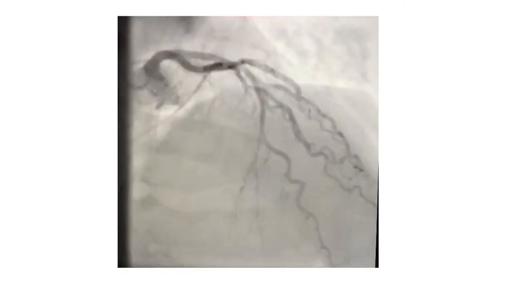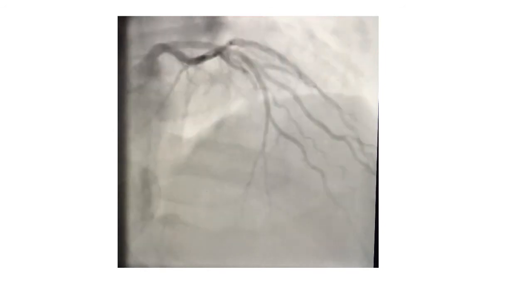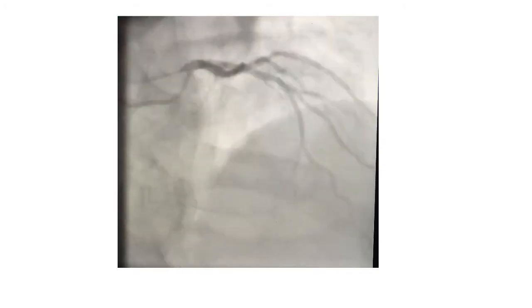The other thing you will see here is that the diaphragm is very prominent. This raises the possibility that this is a cranial projection. In fact, this is an AP cranial view of the left system, and the main vessel that tracks down near the bottom of the image is, of course, the LAD, because as you know, the cranial views are typically best for the LAD.